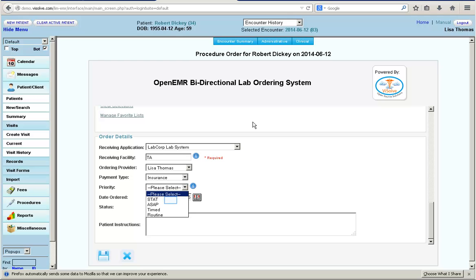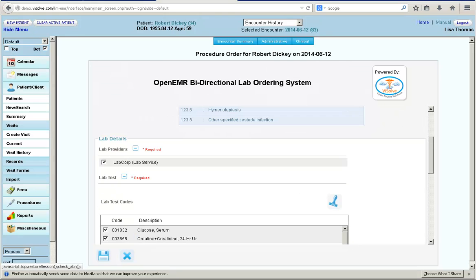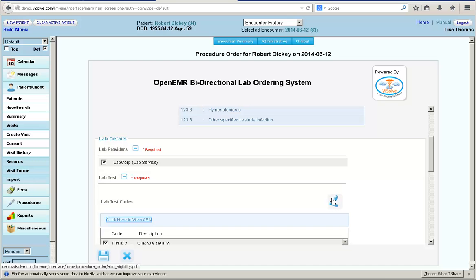Dr. Lisa selects the priority for the lab order from the drop-down. Then she enters any patient instructions, and before saving the lab order, she needs to check for Advanced Beneficiary Notice eligibility to see if the patient's insurance would pay for the tests ordered or not.